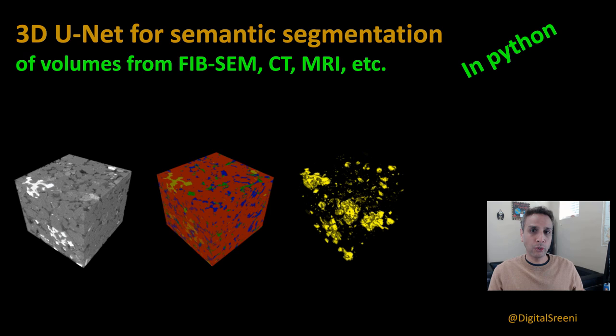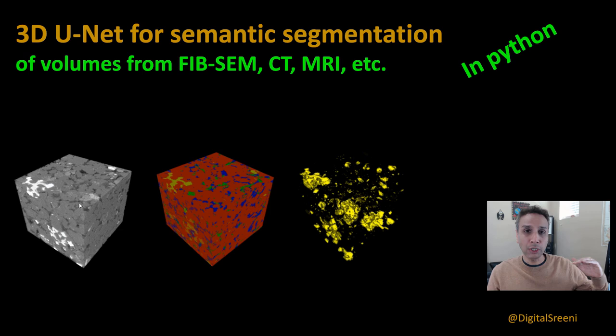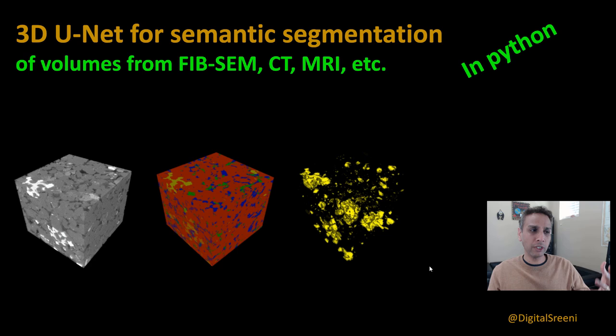I'm not going to show you just a binary segmentation — that's easy. I'm going to show you multi-class segmentation on the same dataset we have analyzed in the past, except in the past we did 2D slice at a time. Now let's take 3D sub-volumes at a time, train our model, and spit out the result as a segmented dataset. I'll show you both a 3D volume output and a 4D volume output — 3D plus each channel as separate channels so you can turn them on and off.